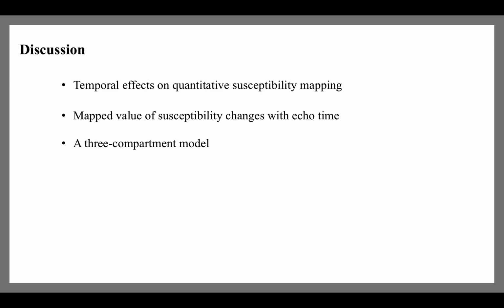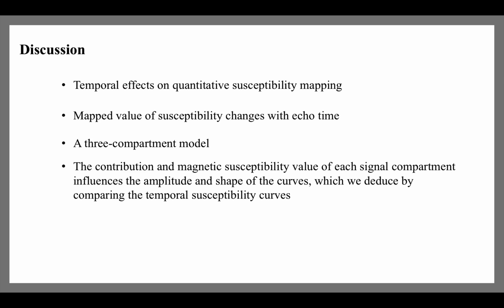We investigated the temporal effects on quantitative susceptibility mapping. By studying 10 brain regions, we have been able to establish that the mapped value of susceptibility changes with echo time. All brain regions exhibited a good fit in the three-compartment model except pallidum. Microstructure of tissue potentially influences magnetic susceptibility compartments and the temporal susceptibility trend. We suggest that careful consideration be given to the acquisition parameters used to obtain quantitative susceptibility maps and how susceptibility values with echo times are used to assess brain changes.